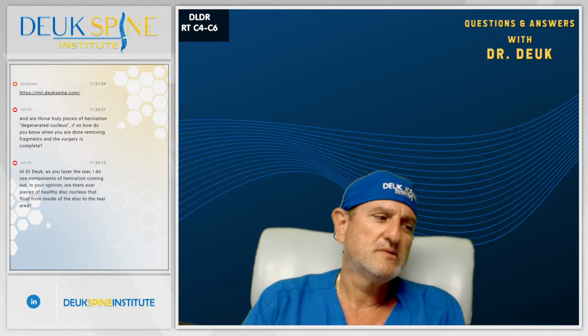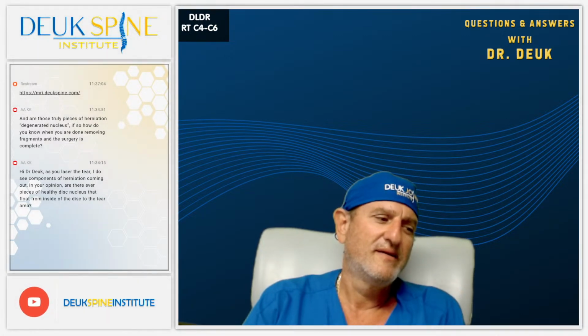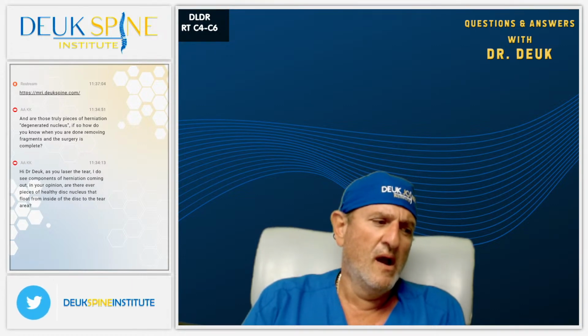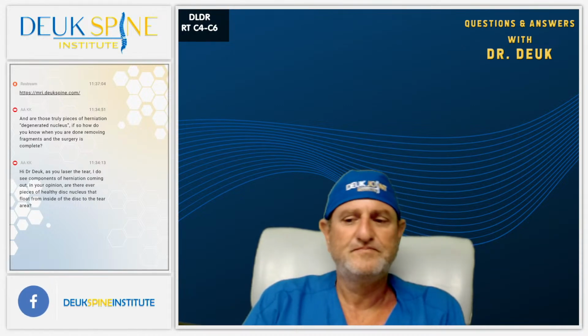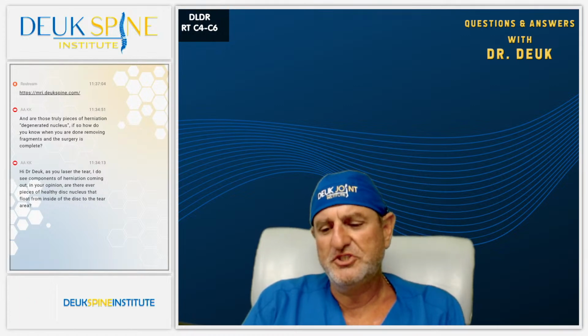What's the other question? This next question is coming from AAKK, who said, "Hi, Dr. Deuk. As you laser the tear, I do see components of herniation coming out. In your opinion, are there ever pieces of healthy disc nucleus that float from inside of the disc to the tear area?" Great question, AAKK.